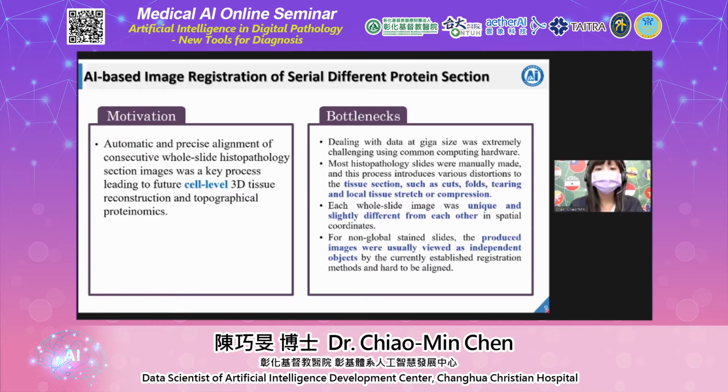Accurate and precise alignment of histopathology tissue sections is a key step for the interpretation of proteome topology and cell-level reconstruction of diseased tissue.